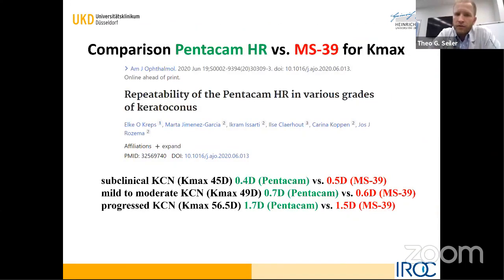Now if we compare this to the Scheimpflug system of Pentacam HR, there was just a recent publication from Belgium in the American Journal showing the repeatabilities for different keratoconus cohorts. And there, for subclinical keratoconus, we are pretty similar with the MS39 compared to the Pentacam. However, if we go to moderate or even more progressed cases, we can see that there's a slight difference regarding the repeatability, which speaks in favor of the MS39 instead of the Pentacam. However, they are pretty similar regarding keratometries.